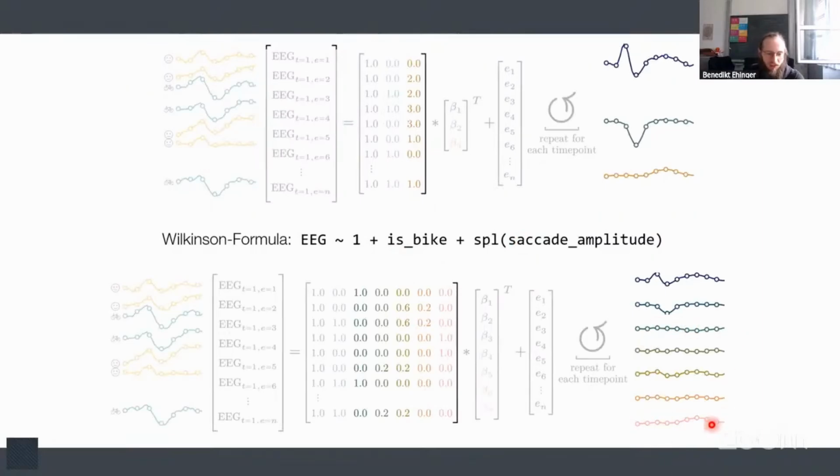And these predictors generally are not straightforwardly interpretable. You can look at one and say, okay, this one has a little bit of activity, probably in the middle. But because the neighboring ones can also always modify this behavior, this is not straightforward. And you guessed, maybe you need marginal effects. Or one easy way to do it is to use marginal effects.